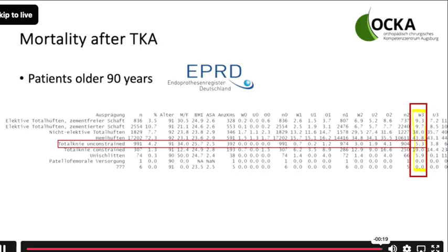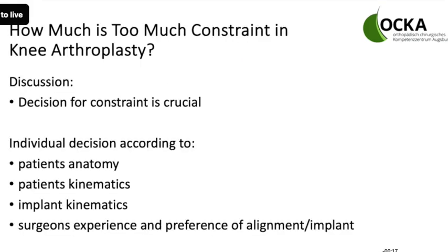Yeah, I think if you have medial instability and insufficiency, I cannot tolerate it at all, because they won't be happy patients, and their data is with medial instability they cannot tolerate. If we have a lateral insufficiency, I tolerate it more, because the kinematics are more movement on the lateral side, and patients tolerate a slight lateral insufficiency, and they can tolerate it. But if you have a medial collateral insufficiency, they don't do it.